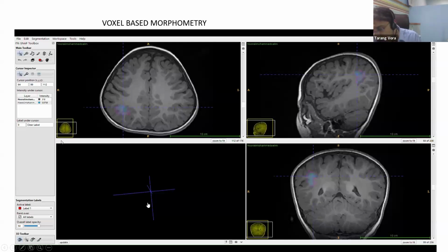This is the voxel-based morphometry of the patient, and this is the highlighted area, which shows that on the morphometric analysis, the shape, size, and volume of gray matter in this region is abnormal compared to the average of 100 patients of a similar age. With the morphometric analysis, the highlighting is there, but when the analysis goes away, you can see very clearly that the underlying brain looks pretty normal. It's not that the gray matter is extremely thickened there, but this is what the VBM showed us.